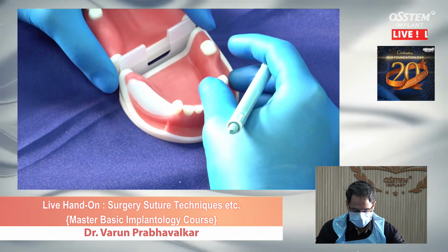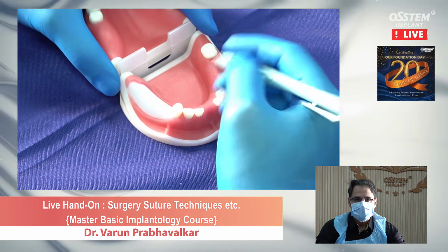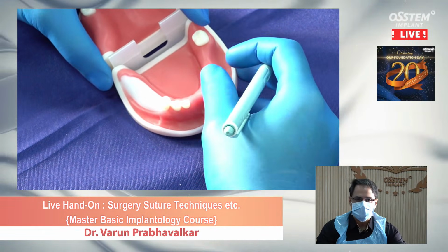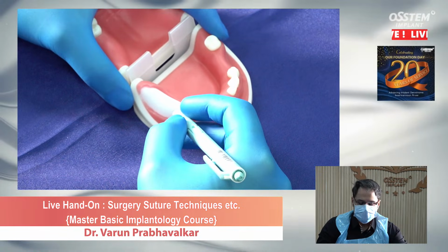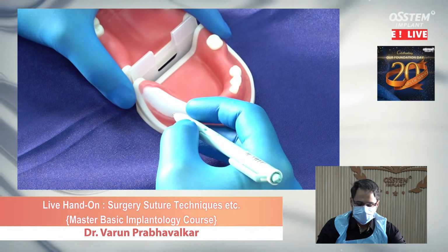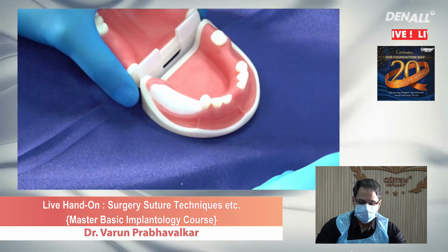the hole in the bone and placing the screw inside. The most important part over there is planning. Now just imagine that we do not have a planning done for this particular patient, but we are going to focus over here on technique because of that. We are going to have a premolar site, and our position is going to be only prosthetically driven, and for that matter we are going to mark our imaginary premolar first.